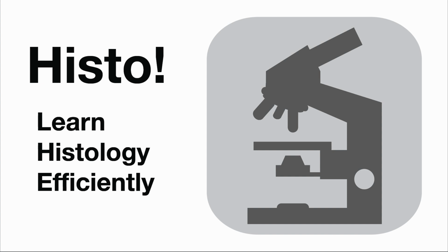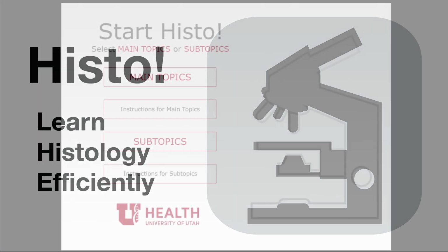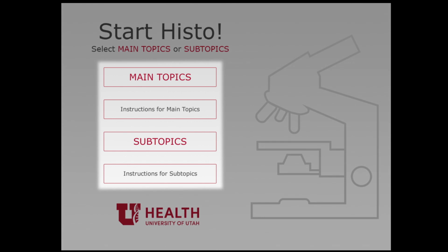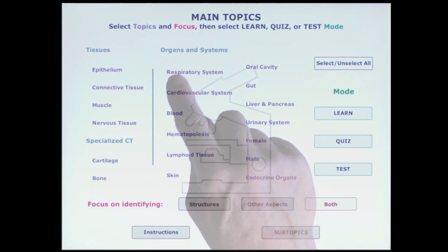The Histo application was developed to help medical and dental students at the University of Utah learn histology. The app opens at the Start menu, where you choose to examine either the main topics or their subtopics. Let's begin with main topics.